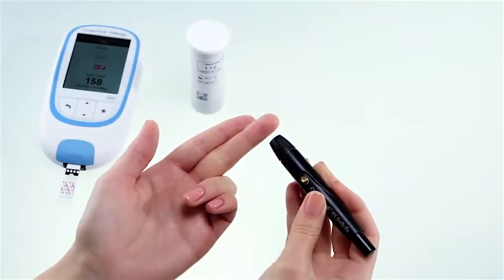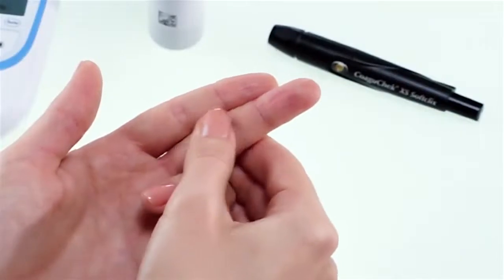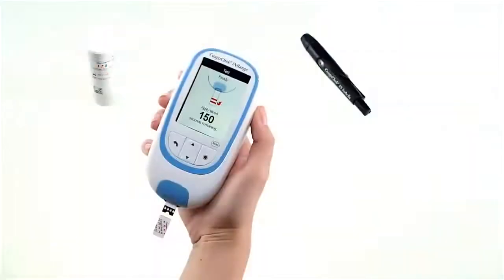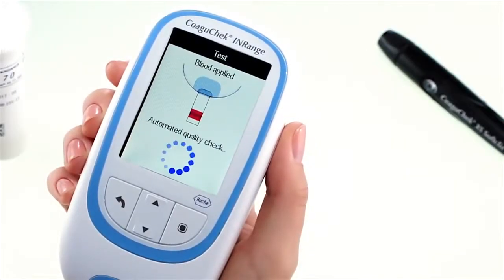When lancing your finger, always use the side of the finger rather than the tip as it is more comfortable and less sensitive. Press the lancing device firmly against the side of your finger and press the yellow release button. Lightly massage the lanced finger in the direction of the fingertip until a drop of blood is formed. Apply blood directly from the finger to the sample application area of the test strip and let it fill. You must apply the blood drop to the test strip within 15 seconds of lancing the fingertip. Applying blood after this time period may cause an inaccurate result as the blood may have already started to clot. When enough blood has filled the strip, the meter will let you know by beeping. The blood drop symbol will disappear and the test starts.